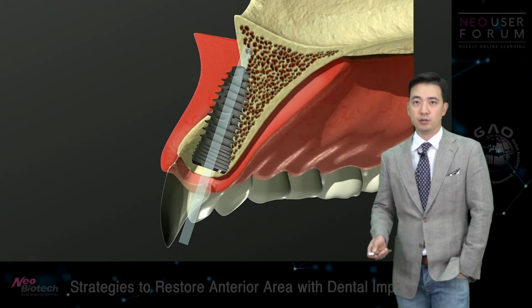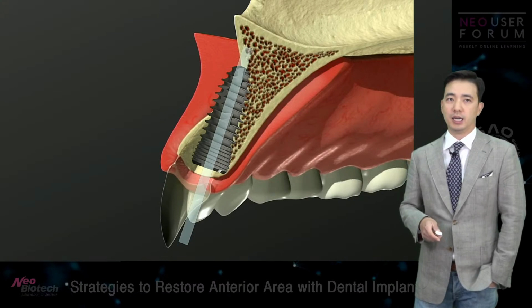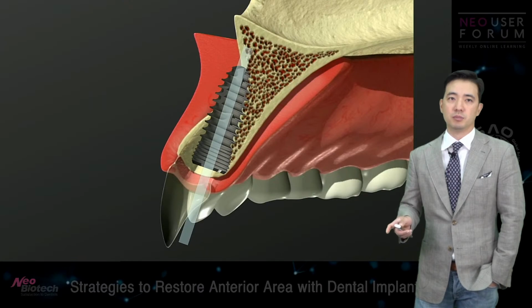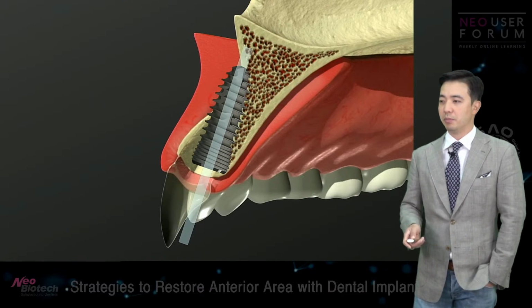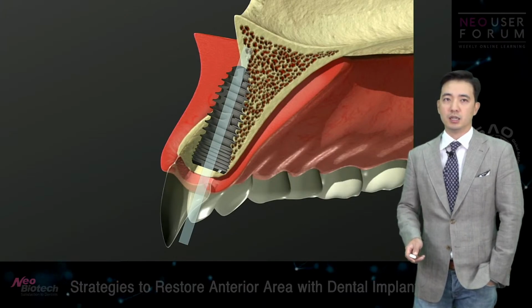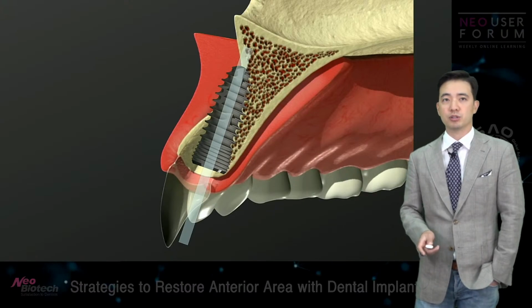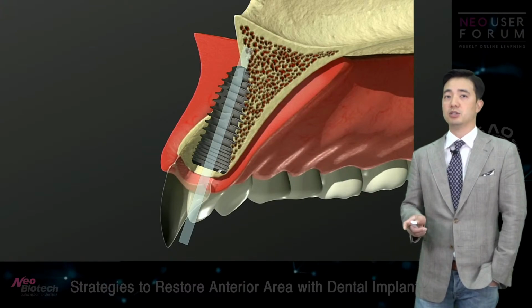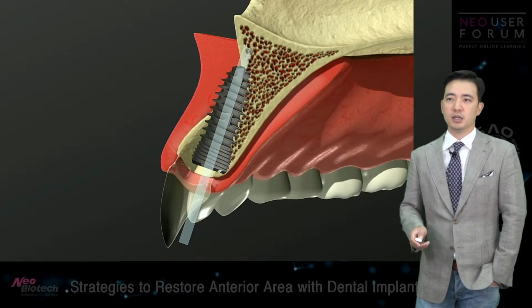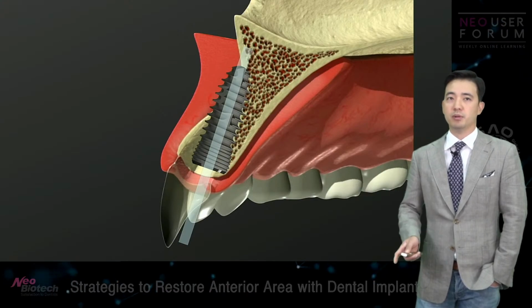What I personally want to do is still go for this kind of position, because your implant is going to last in your patient's mouth for decades. Just because it's easier to place the implant according to where the patient's bone is doesn't mean that whatever prosthesis you put in the patient's mouth is favorable for the patient.